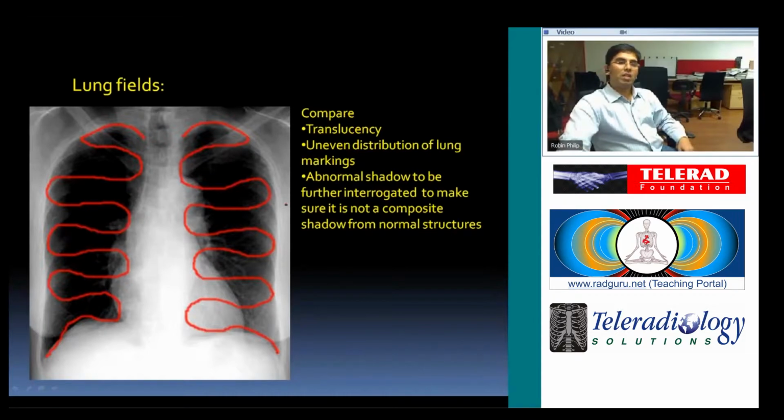You have to sweep through the lungs in a systematic fashion so that you do not leave out any portion of the lung. And then you should always compare with the opposite side for any change in pattern. So that comparison really helps, comparing it to the opposite lung. So always follow a pattern, examine each and every part of the lung so that you do not miss small nodules or any abnormality.